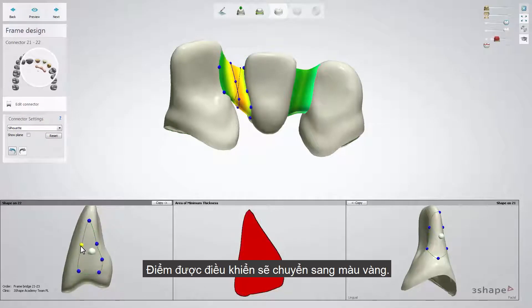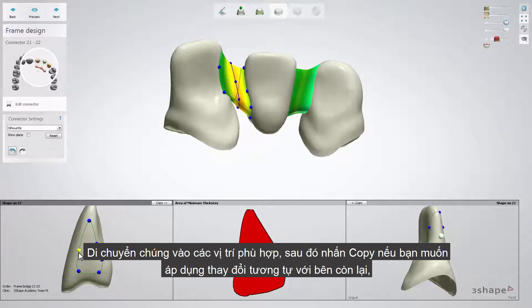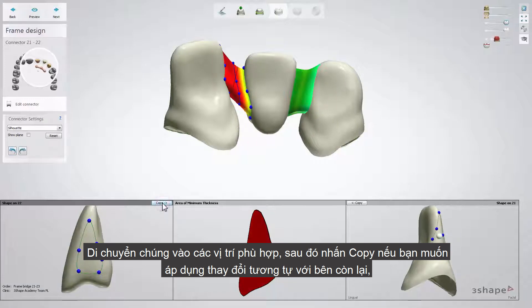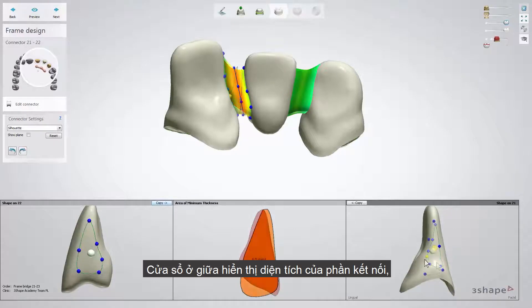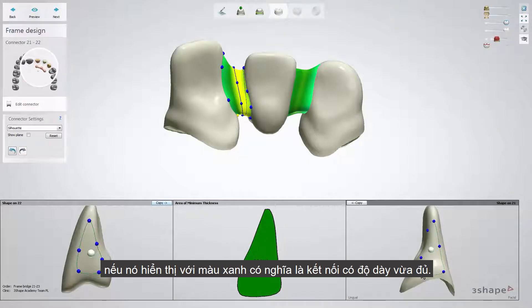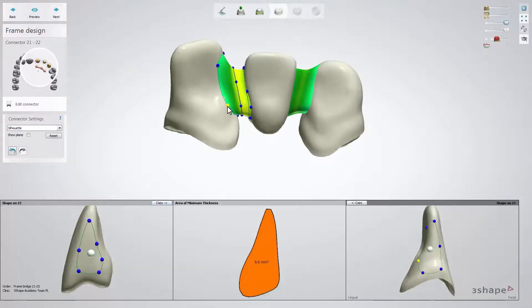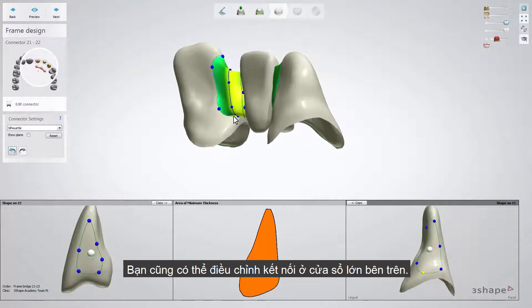It allows you to modify connectors directly in these windows by dragging their blue points. The points turn yellow when active. Move them to the correct position and when ready, use the copy button if you wish to apply the same changes from one side of the connector to the other and then modify it. The area of minimum thickness window shows the 2D cross-section of the connector and is color-coded. The green color means that the connector has sufficient thickness. You can also edit the shape of the connector directly in the main window.